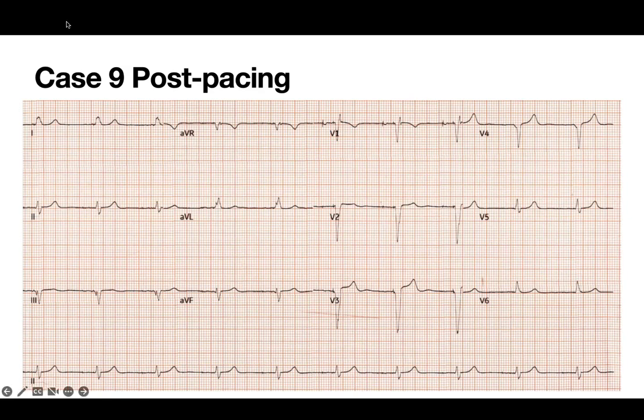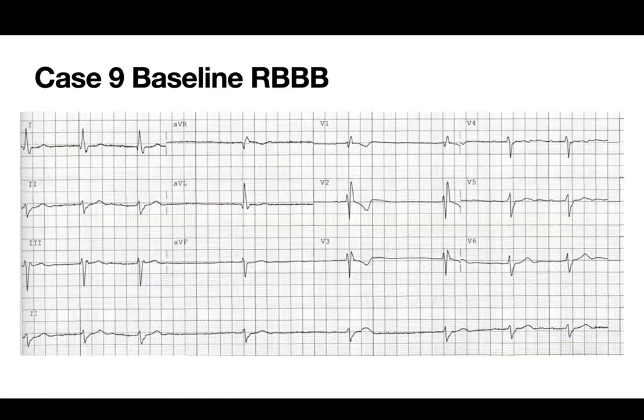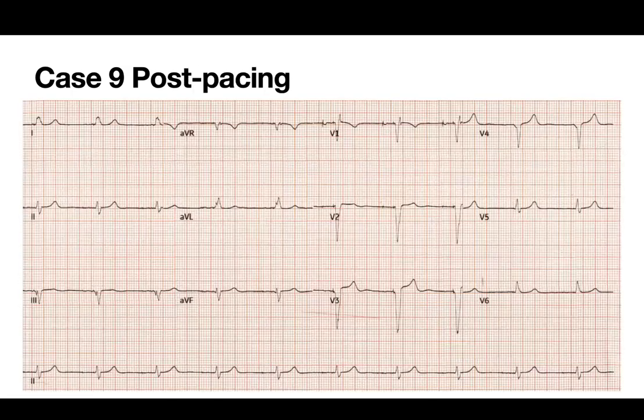Dr. Paredes? Yes, I mean, it depends on what you are working for. If you are working just for an almost normal ejection fraction, that's more than reasonable, and instead of getting more trouble, I will just stop there. If you're working for a patient with 25% ejection fraction, maybe you need to have an LVAT as short as possible. And if you have 60, well, that's better than 80. So it depends on what you're working for. This patient's EF was between 50 and 60%.